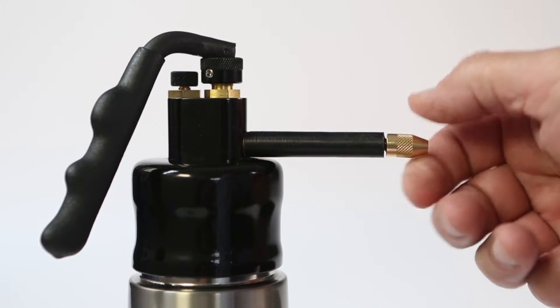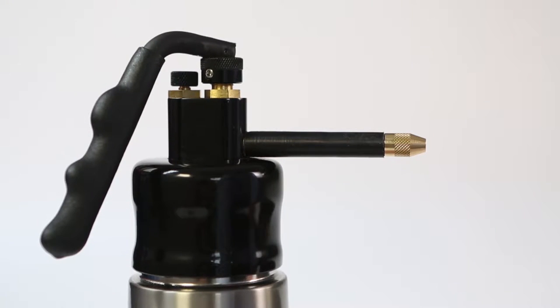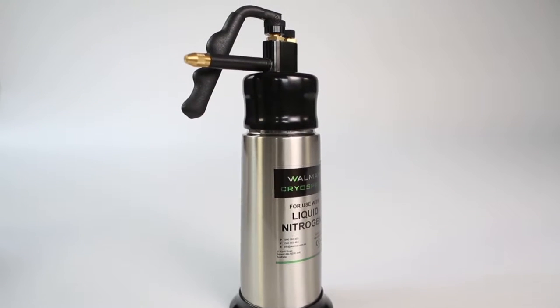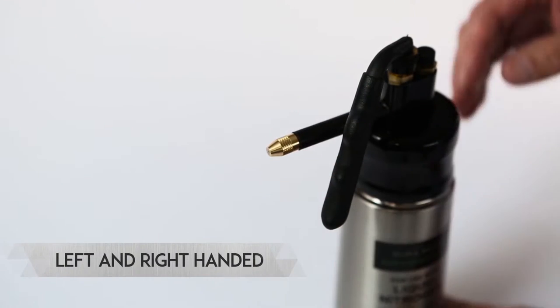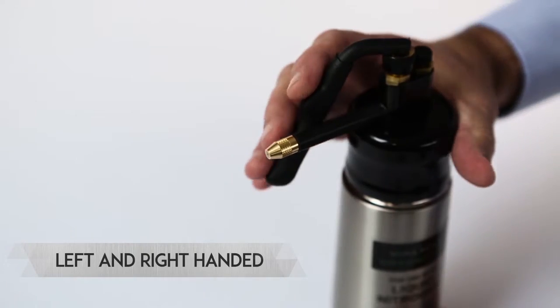Hold the knurled end of the probe and screw it into the brass outlet thread. The regulator handle can be positioned left or right, adjacent to the probe.